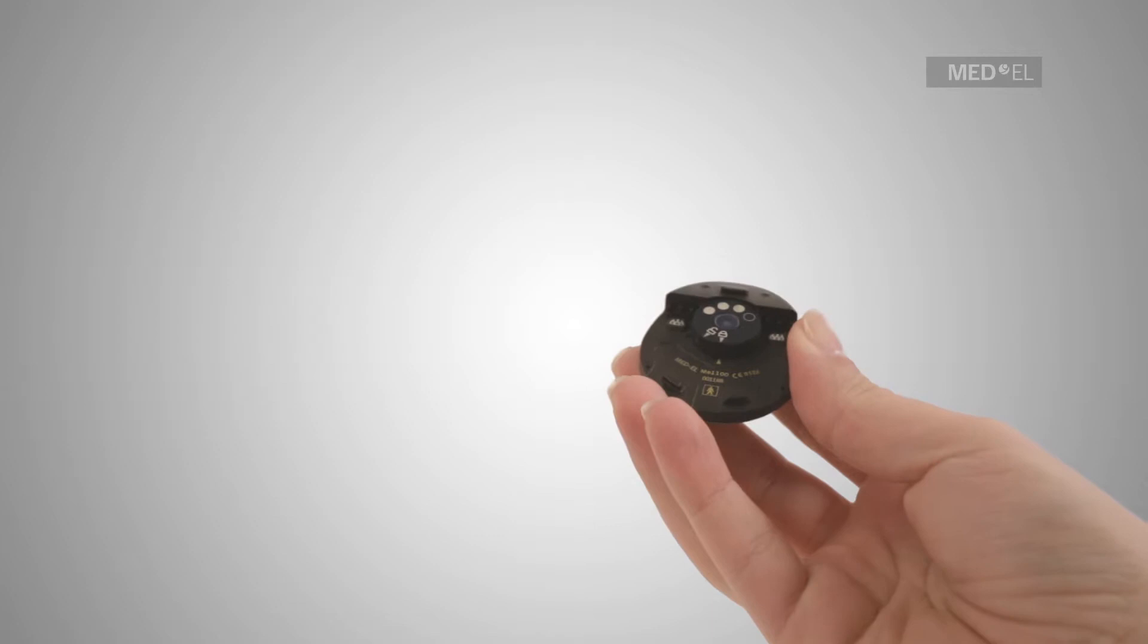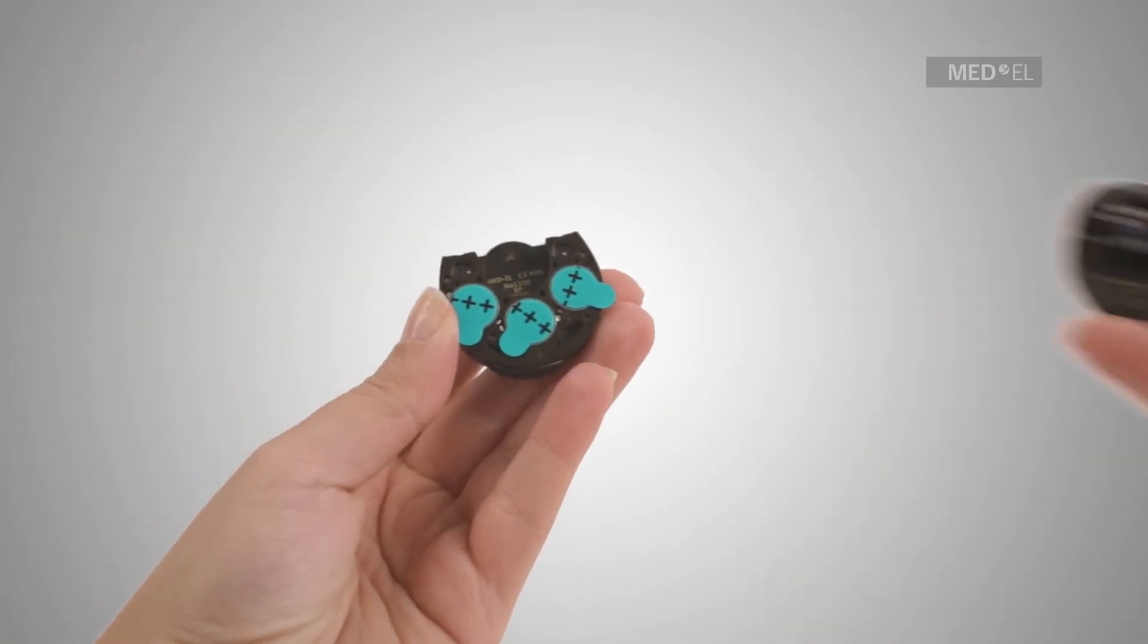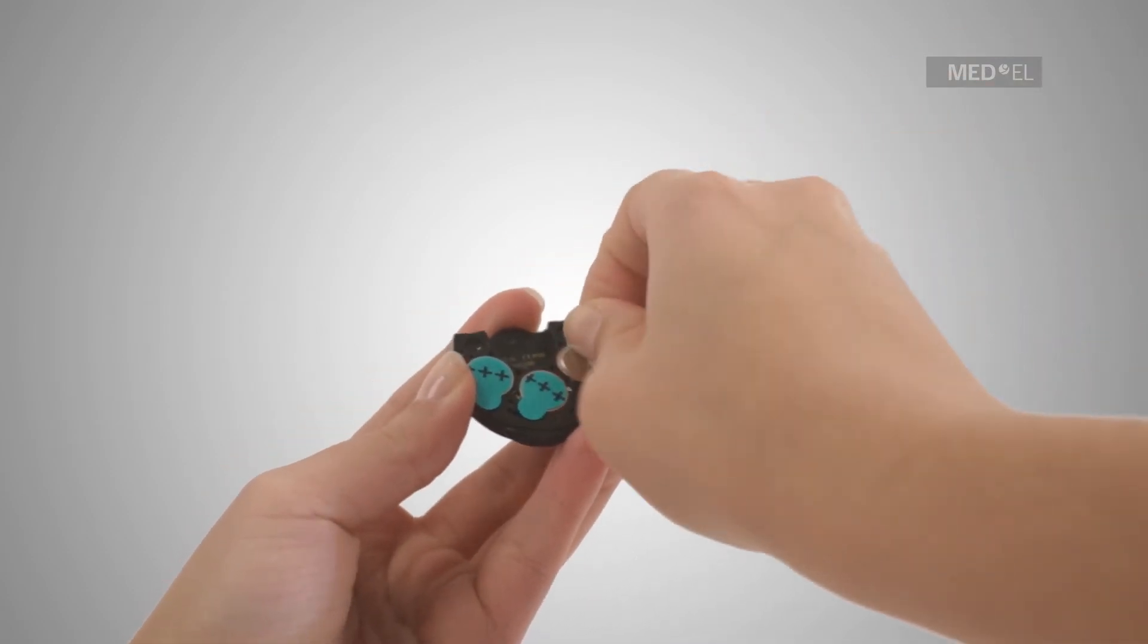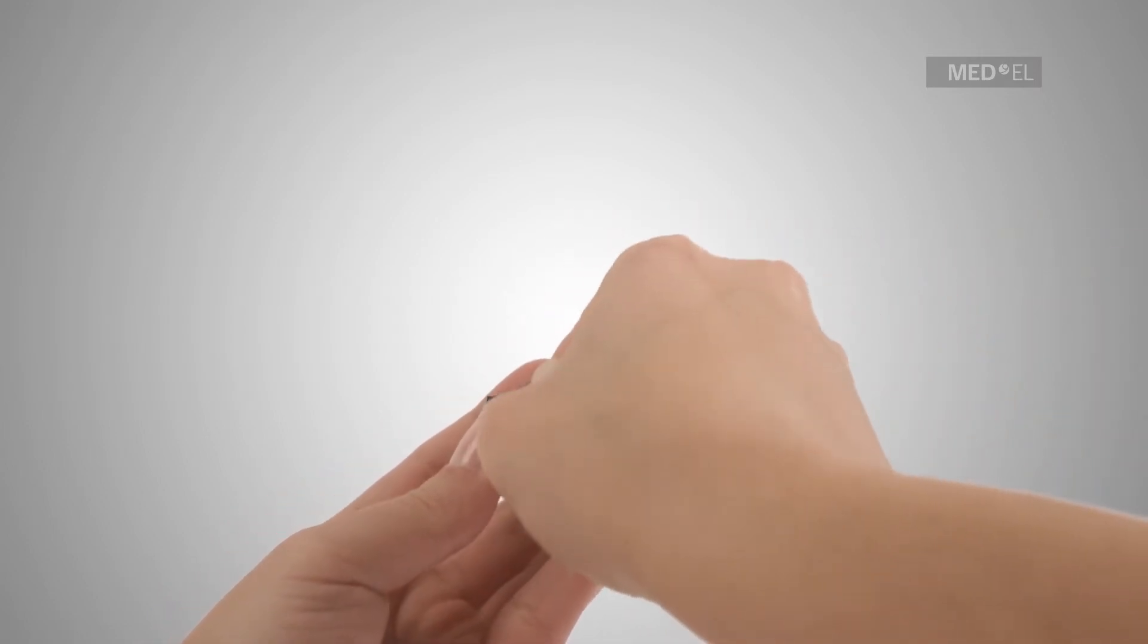The foil covering the zinc air batteries must be removed before use. Ensure that the PLUS pole is facing outward. When correctly inserted, the PLUS sign will still be visible after insertion.